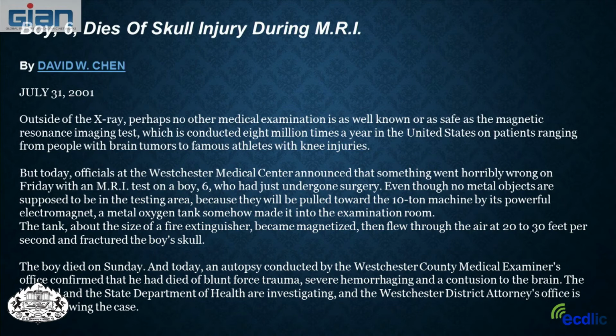So in 2001, this sort of freak accident, as they called it: a boy, 6 years old, was being scanned at the Westchester Medical Center, and somebody brought an oxygen tank into the room with him while he was in the scanner. Officials said that something went horribly wrong on Friday with an MRI test on a 6-year-old boy who had just undergone surgery, even though no metal objects are supposed to be in the testing area, because they will be pulled into the 10-ton machine by its powerful electromagnetics.